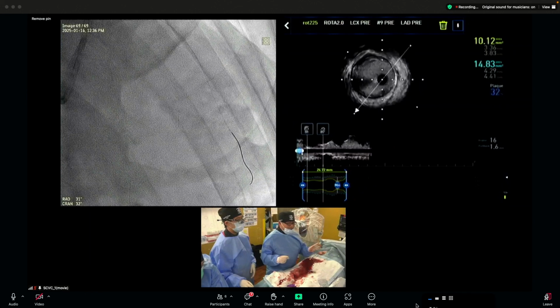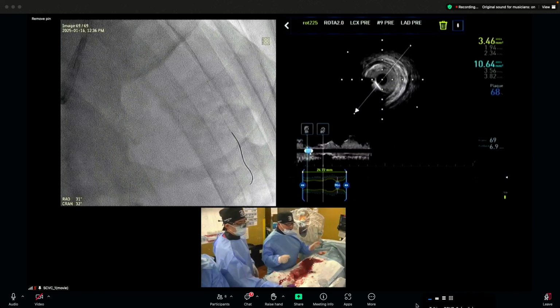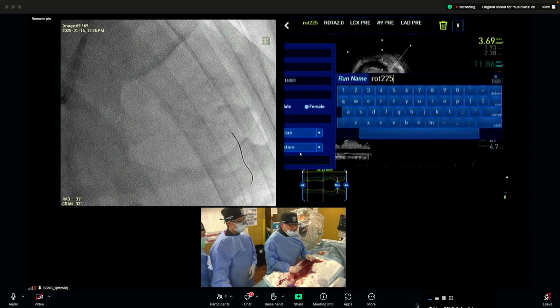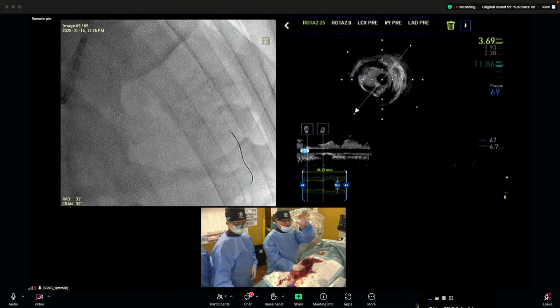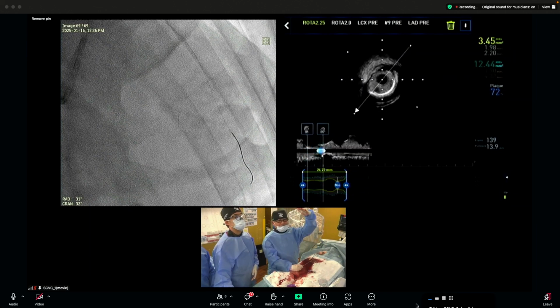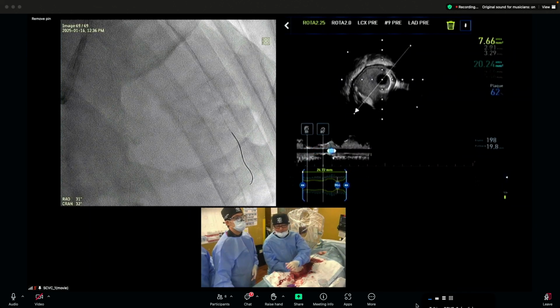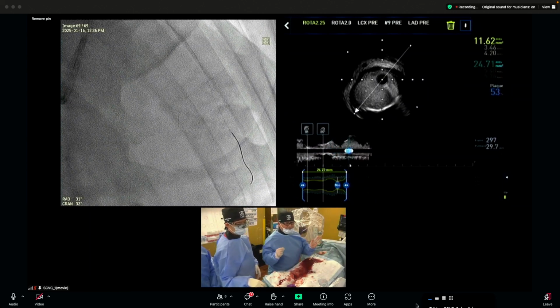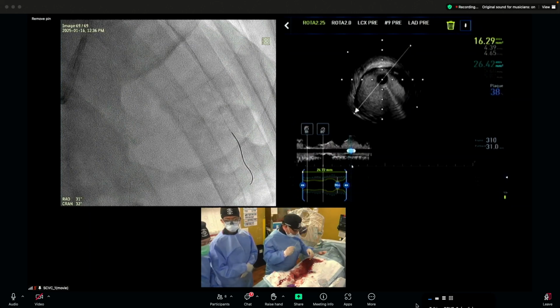However, currently we continue to use 140,000 to 160,000 slow speed rotablation to get extra acute gain. It's one option. However, at that time the rotablation bar makes an orbital movement like OAS, so differential cutting performance gets lower. So if you find a risky point, of course, you don't use slow speed rotablation.